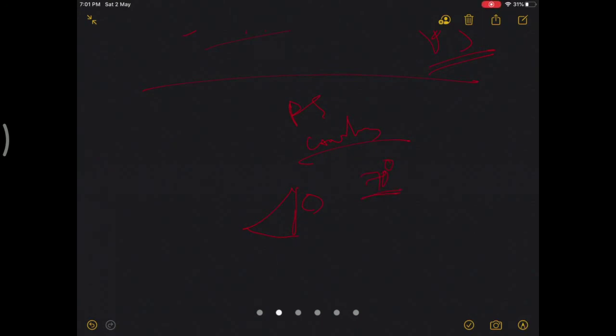So each time a patient flexes, there is a lot of strain transmitted to this cam and post, because it has to act as a constraint, and this is transmitted to the prosthesis cement bone interface. There is a possibility of increased osteolysis and loosening because of this strain transmitted to the prosthesis cement and bone interface.